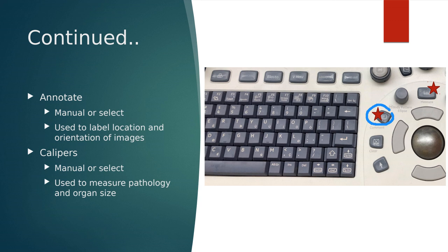So if you selected the abdominal preset, you're going to get all of these options that you can just easily tap, and they'll pop up on your screen so you don't actually have to type them out. You'll have pancreas, liver, gallbladder, all those common annotations that we would use for that specific preset will be under that category.